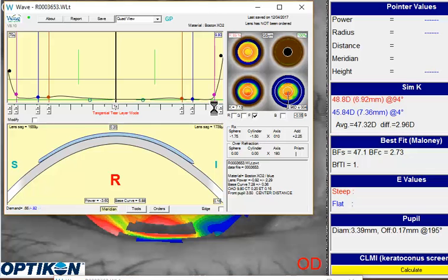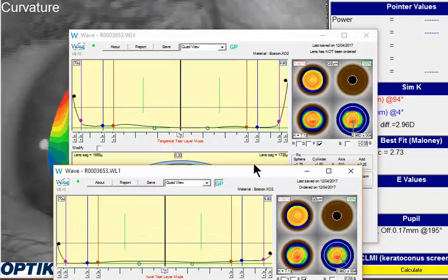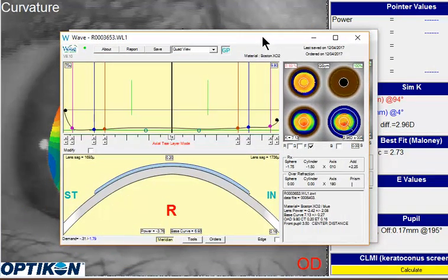Don't forget to leave enough tear exchange, lift up on that pink dot a little bit, make sure you have enough clearance so that way this lens doesn't seal off. I think those couple of tips may help you get a little bit more on track with this patient.